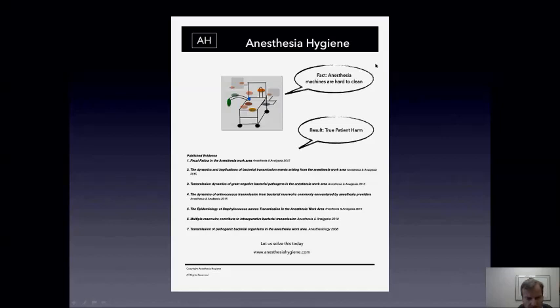An operating room is often not looked into carefully. So that's definitely a potential carrier. You just have a bug sitting there. All you need is another patient, a viable human being. No matter what your glove is, or if you change gloves, or even if you use alcohol, if it's sitting there on the machine, it's going to go to the next patient. The other thing Dr.